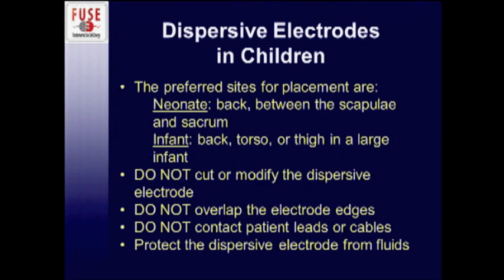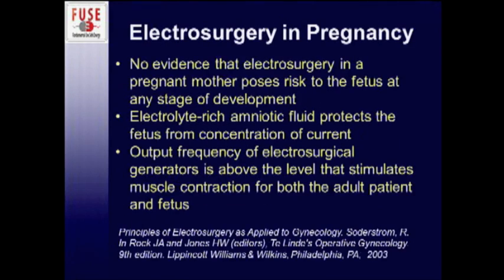Just one note, dispersive electrodes used in radiofrequency ablation do have those longer periods and high concentration of heat, and that increase in heat in the dispersive electrode can cause burns. And so some of the recommendations, if these are used in children in solid organ surgery, is if you have a heater under the patient, which you often do, is to consider keeping that heater off until your ablation is done to help prevent burns at that dispersive electrode.